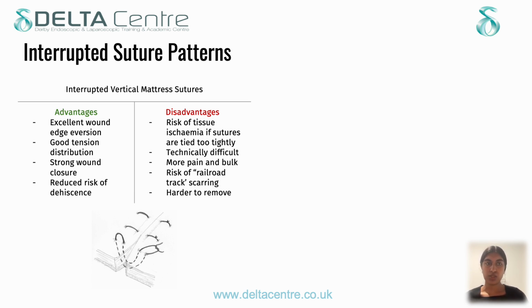Advantages of this include that there's excellent wound edge eversion, as this technique pulls the wound's edges outwards and upwards, which helps to prevent the wound from healing with an inward rolling. This reduces scarring and promotes better cosmetic outcome. There's good tension distribution, as both deep and superficial tissue layers are incorporated. This relieves stress from the superficial layer.